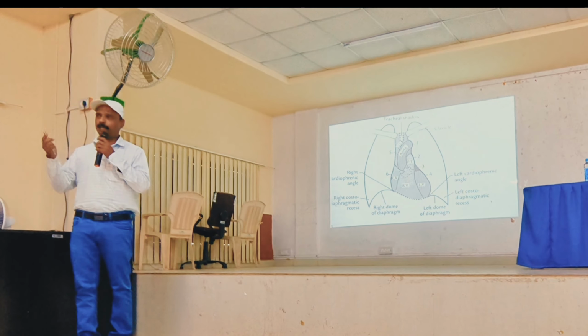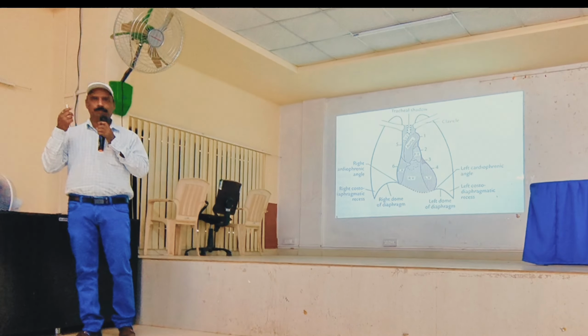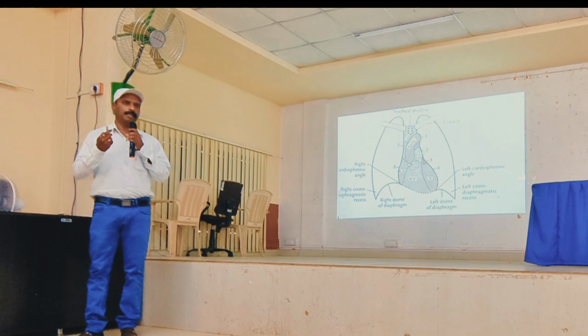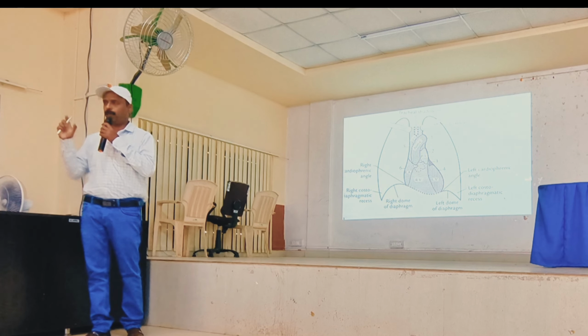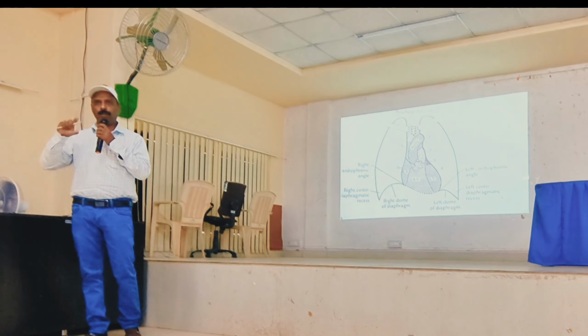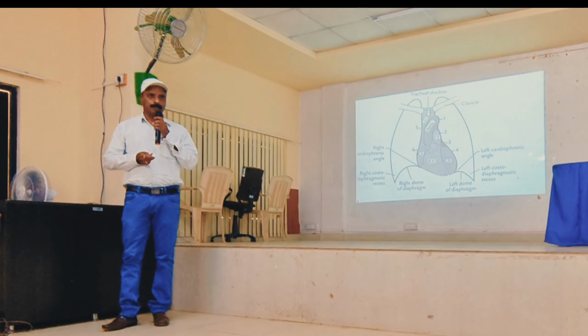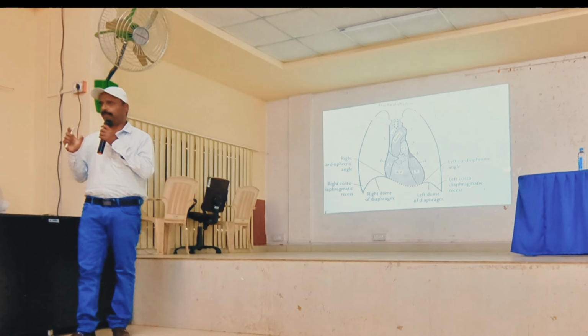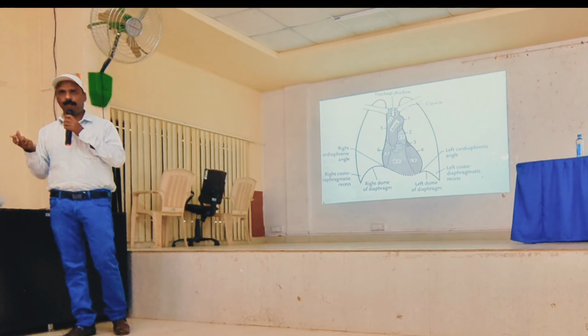Most commonly, even till the final year, we see that the reading or diagnosis of the PA chest is not done properly. If you have studied the PA chest properly, you can go for the other related comments. This is the basic thing I am going to highlight today: how to read and how to comment, that is all.